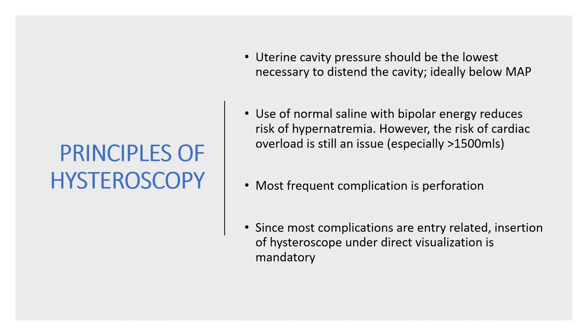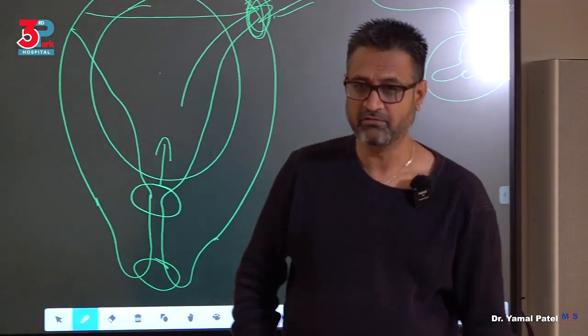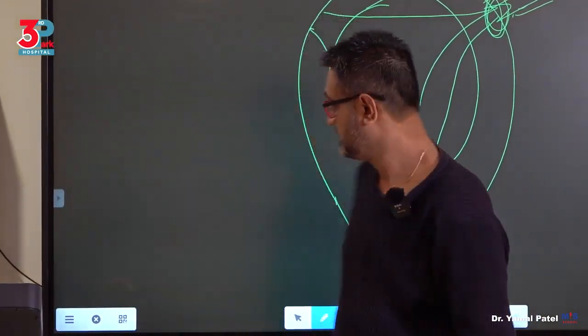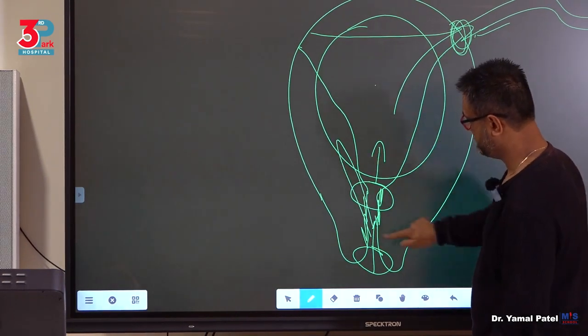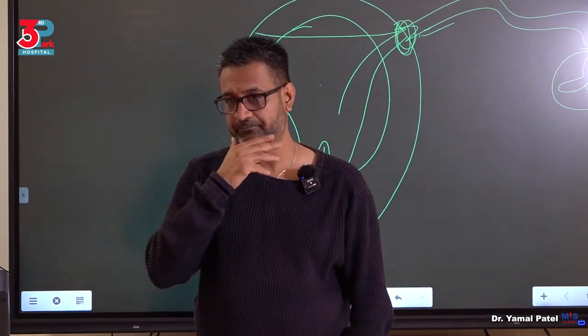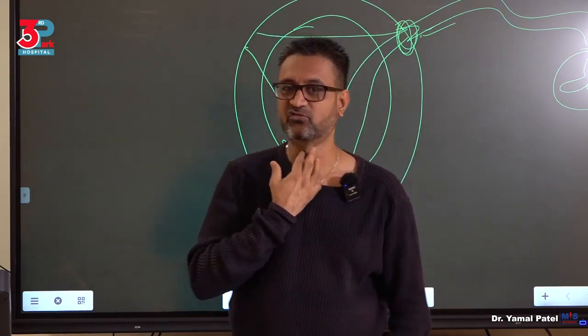Obviously, another complication, that is perforation. It's not a principle. Now, most complications are entry related. So one of the other things that I have been doing over the last 10 years, I do not dilate the cervix. So you shouldn't dilate the cervix, because when you dilate the cervix, you are damaging maybe this, you may go into a false passage, all those things can happen. Agreed? You may perforate. So the approach of choice should be vaginoscopic approach.